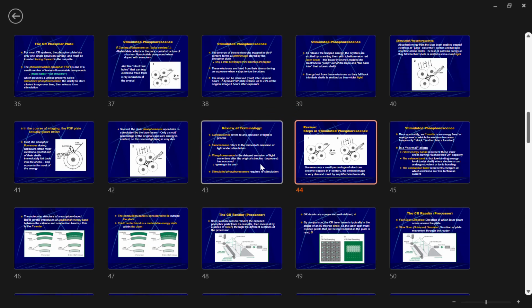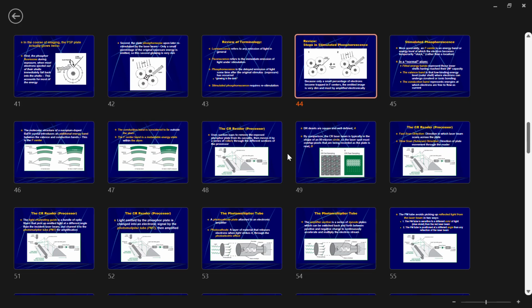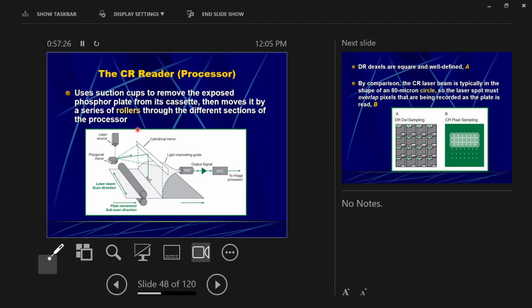Okay, there are some unnecessary complications that we could get into that I won't, so I'm going to move forward. So let's describe a little bit about how the processor works, okay? Now, all of this that you're seeing here is done inside of a closed off thing. You never ever see inside of the processor, okay? But it's useful to get an idea about what's happening here.